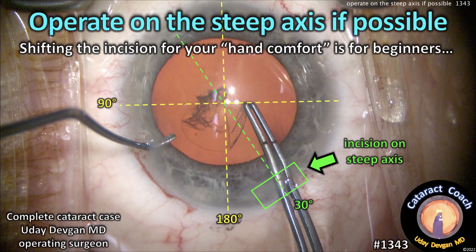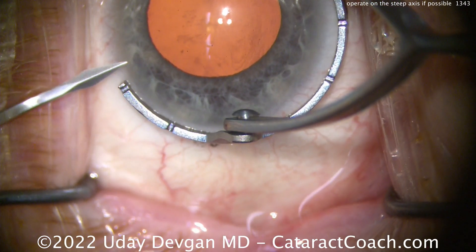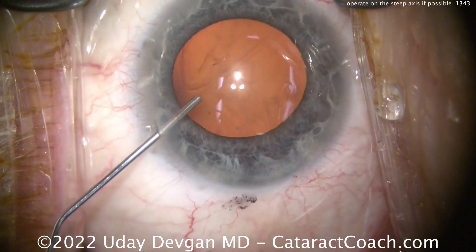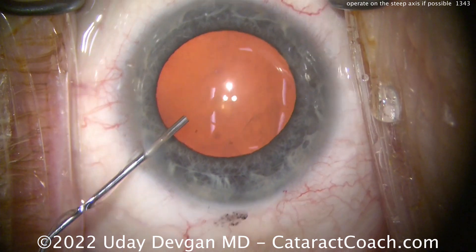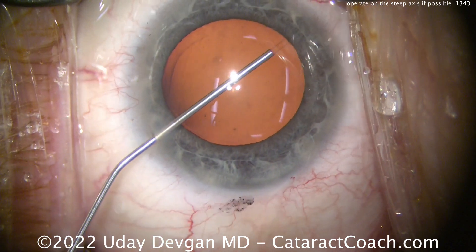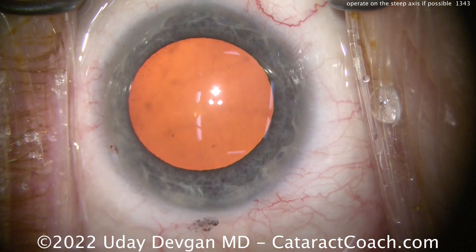At cataractcoach.com, operate on the steep axis if possible — shifting your incision for hand comfort is for beginners and you need to move beyond that. There's our patient; you can see we've got ink marks at the zero and 180 degree meridian. There's a little cyclotorsion, which is common, so we mark the patient sitting up pre-operatively. As they go supine on the OR table there can be cyclotorsion. Filling up the eye with dispersive viscoelastic — we're going to show you the whole cataract case.